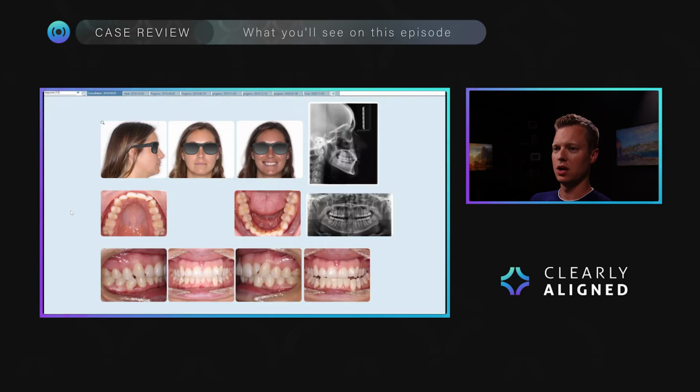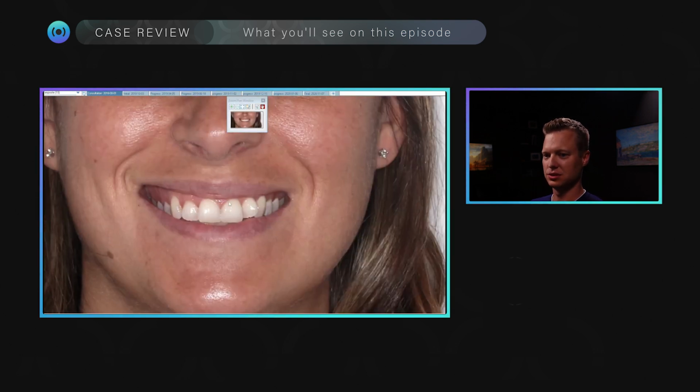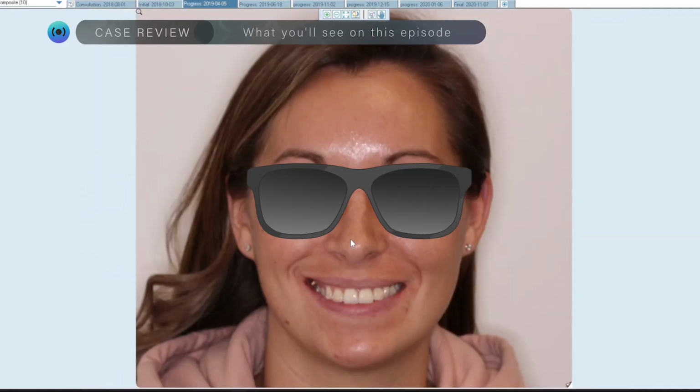So what are temporary anchorage devices and when would you use them? So this is a patient who presents to our office. She's got a cant. So when we look at her smile, her quad 2, her upper left, sits higher. Look at the canine positions. So it sits higher than her upper right. This is 6 months. The TADs can actually move teeth quite quickly, relatively speaking. Now we're at refinement. So what do we do at refinement?